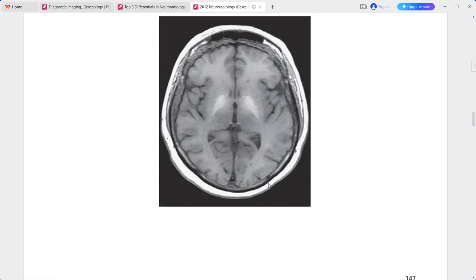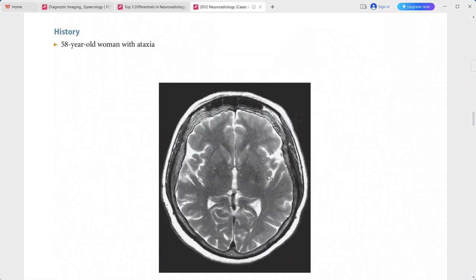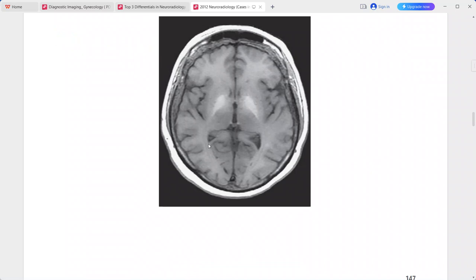Next is a 58-year-old woman presenting with ataxia. The T2-weighted image appears quite normal with no definite abnormality. However, on the T1 image, there is symmetric, abnormal, relatively uniform hyperintense signal within the globus pallidus bilaterally.